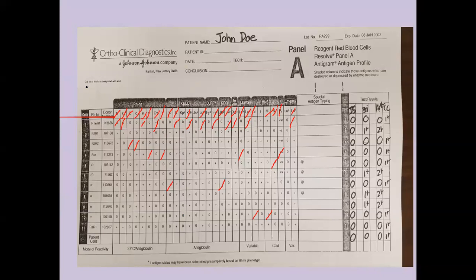So we have to say can't rule out. I'm trying to abbreviate here. KPA, we can't say anything about it. We know it's a low frequency antigen. It's not represented on these panel cells, so there's no pattern to match. When we move on to JSA, we see the same thing. It's another low frequency antigen of the KEL system, and so we can't rule that one out either.